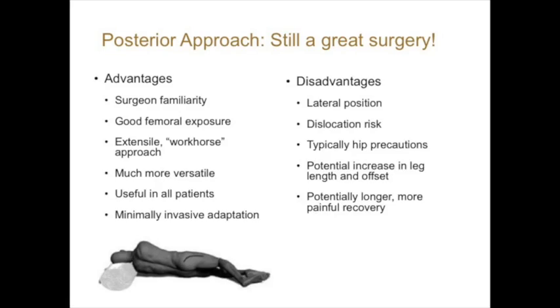And a posterior approach is still a great surgery. Dr. Shields gave a great talk, and I agree with everything he said. We do a minimally invasive posterior approach here, and it's a great surgery. Advantages include that it's familiar to a lot of surgeons. The majority of people train on this approach and do this approach much more often than an anterior approach. It's good femoral exposure.